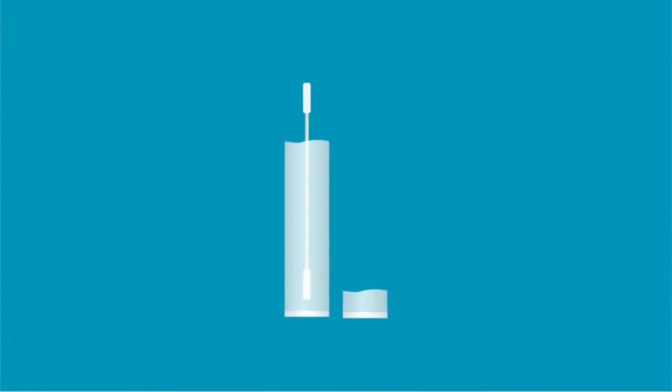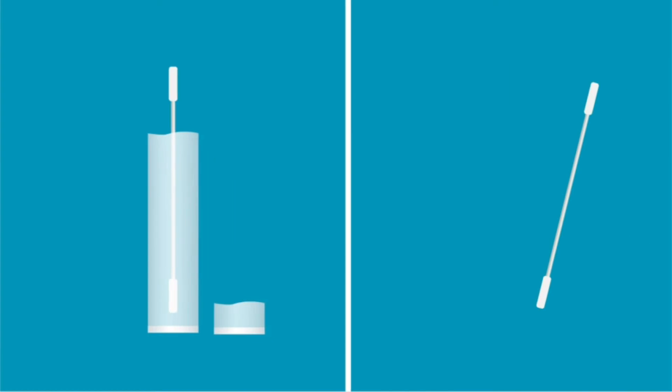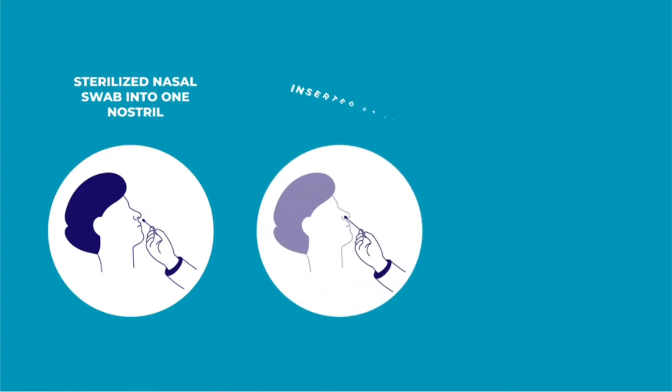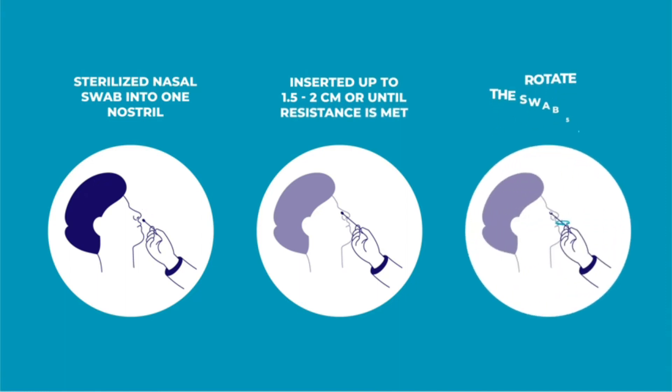Carefully open the sterilized nasal swab package at tail end and take swab out. Insert the sterilized nasal swab into one nostril. The swab tip should be inserted up to 1.5 to 2 cm or until resistance is met. Rotate the swab five times inside the nostril to ensure adequate cells are collected.